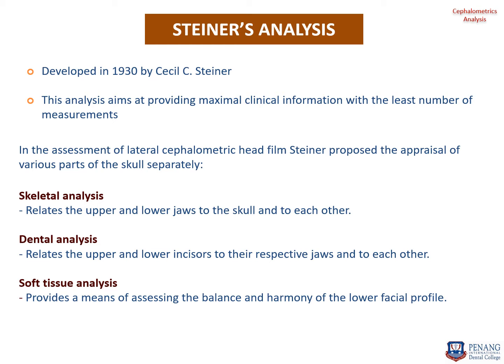So skeletal analysis is basically to relate the upper and lower jaws to the skull or the cranium and to each other. Dental analysis will entail the relationship between the upper and lower incisors to their respective jaws and to each other, whereas the soft tissue analysis will provide a means of assessing the balance and the harmony of the lower facial profile.